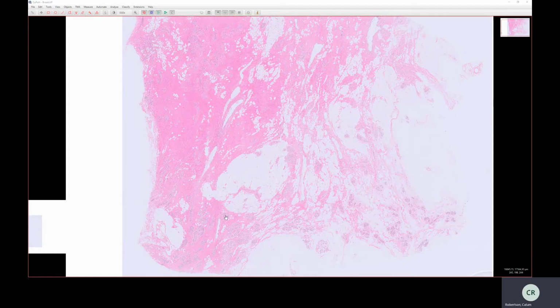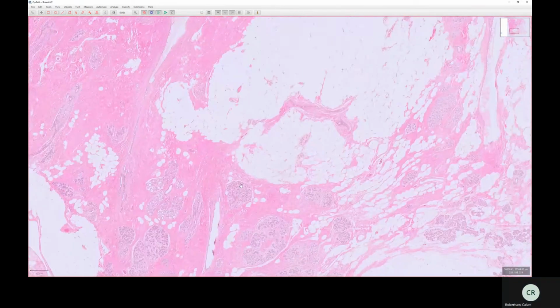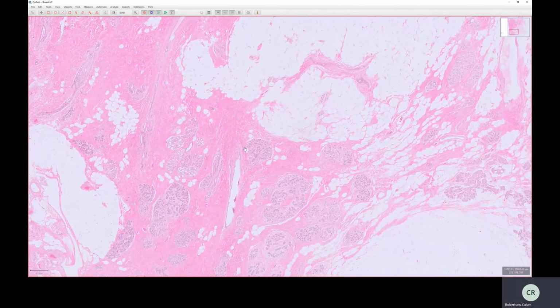And if we zoom in for a little bit, you can see that. So if we look at this lobule here, we can see the small glands radially arranged in what we call an acinar arrangement. Acini, I think, means berry. So if you imagine a raspberry, a raspberry is formed by all these small round structures which are clumped together to make the whole raspberry, just like these small glands aggregated together to form a whole lobule.